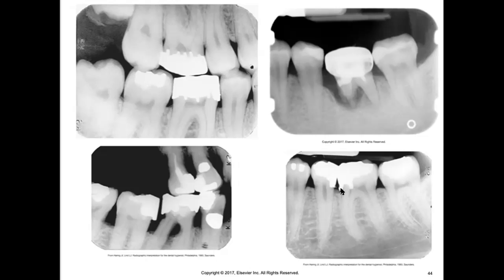Okay, so here is another poor margin adaptation. Here, the dentist probably should not have restored that tooth if the decay was going to get so far underneath the tooth that it would prevent the patient from cleaning underneath here. So this here is not gum tissue, this is bone. This means that this restoration went all the way to the bone. So there is no possible way that a patient can get floss underneath there and effectively clean it out. So we can already see some signs of bone loss around or underneath those restorations.